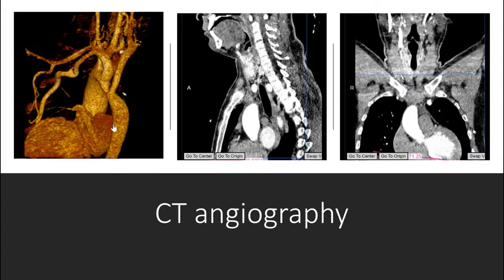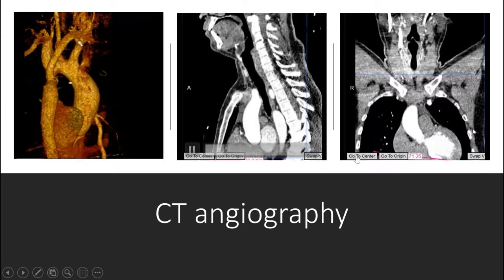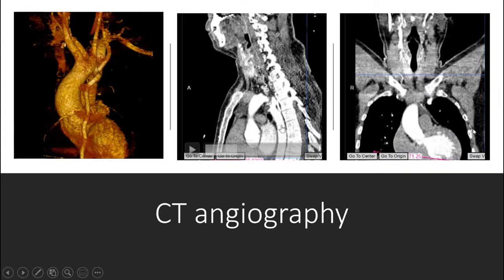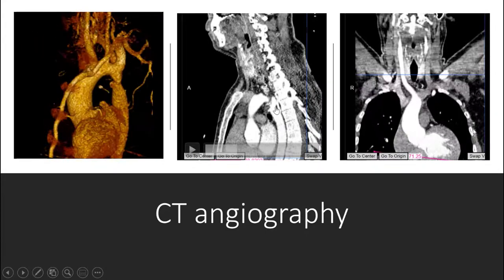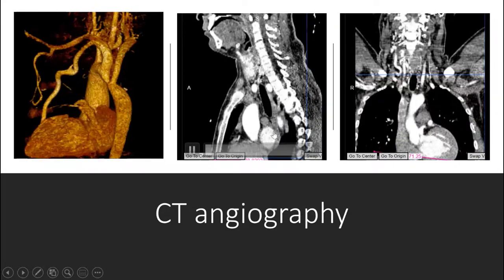CT angiography showed post-ductal aortic coarctation. You can see the coarctation after the left subclavian artery and before the insertion of the right subclavian artery. You can also see the anomalous origin of the right subclavian artery. In sagittal views, you can see here the origin of the right subclavian artery.